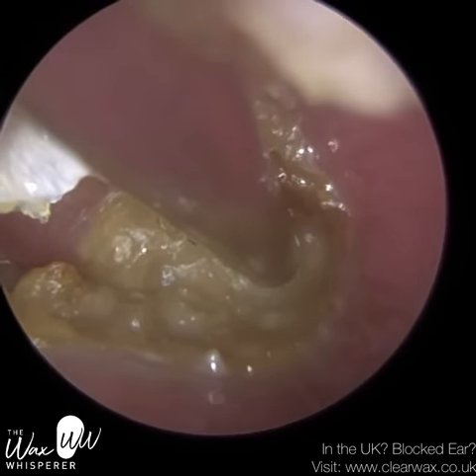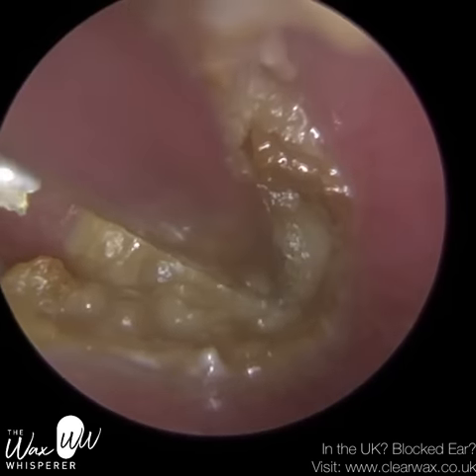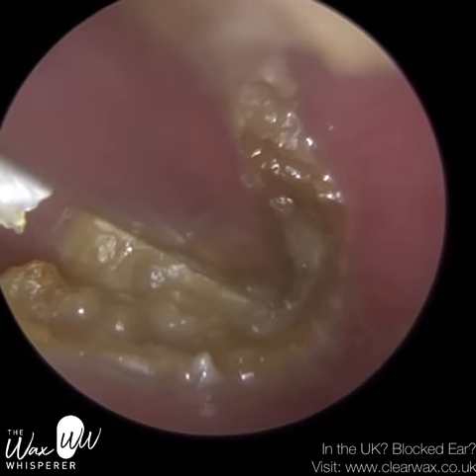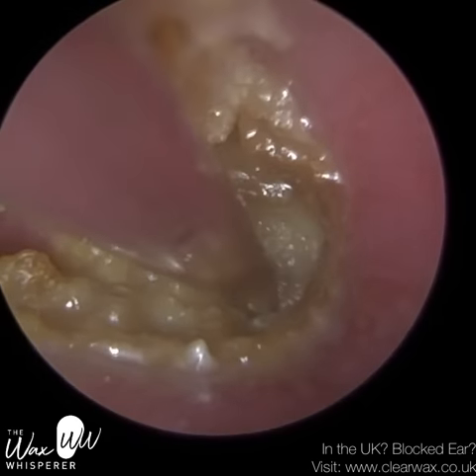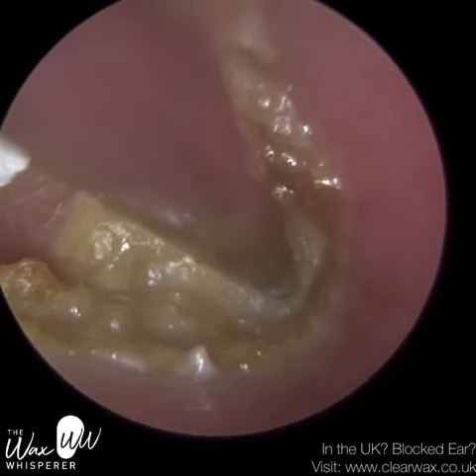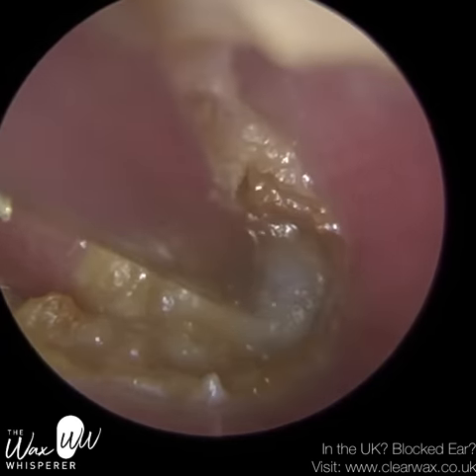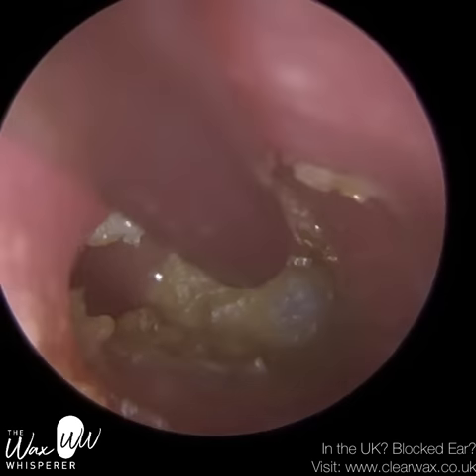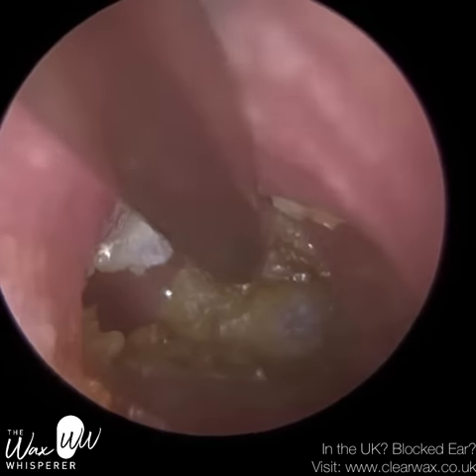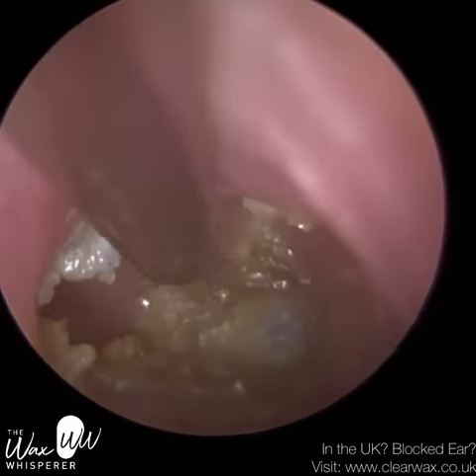Checking the records, the patient has to attend every six months. They've been to a number of clinics, but they found me a few years ago and have been coming ever since. It is challenging — one of the more complex patients that we treat. On occasions I can get this done well within half an hour, but on this occasion it just took a lot longer.